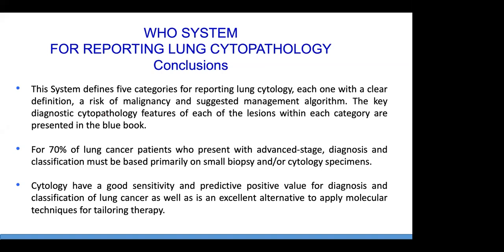So to conclude my lecture, I say to you that the WHO system defines 5 categories for reporting lung cytology, each one with a clear definition, a risk of malignancy, and a suggested management algorithm. The key diagnostic cytopathology features of each of these lesions are presented in the Blue Book.